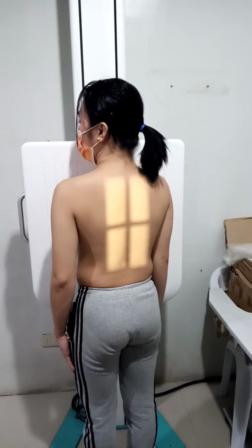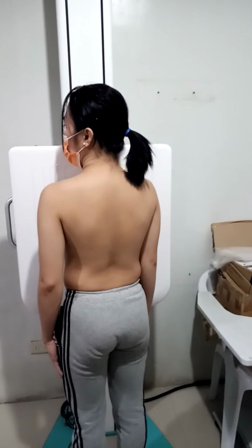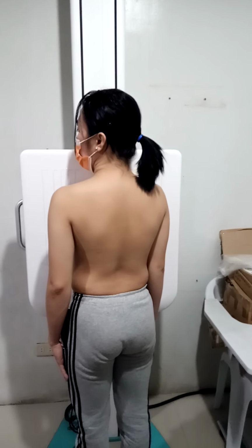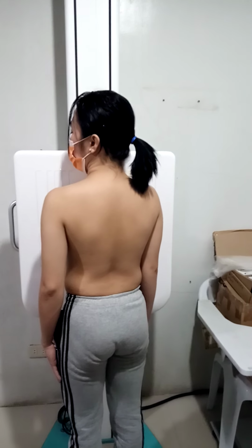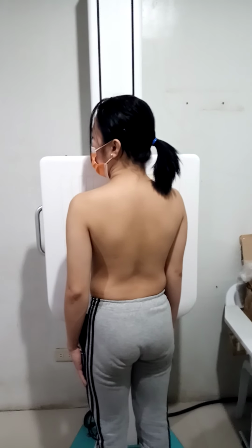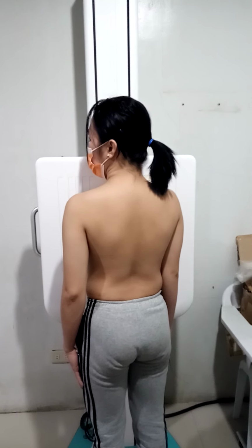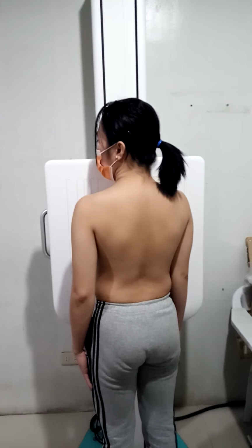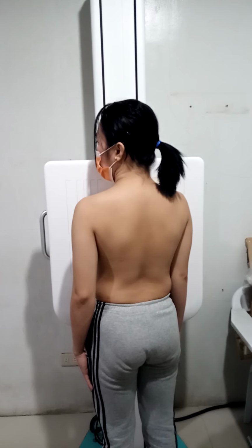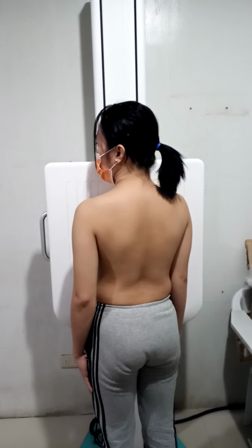I think that's the point. Then, in the oblique or RAO position of the sternum, the evaluation criteria must be: the anatomy demonstrated, which is the entire sternum superimposed on the heart shadow. Then, in position, correct patient rotation. The sternum must be visualized alongside the vertebral column, and there should be no superimposition of the vertebral and the sternal images.